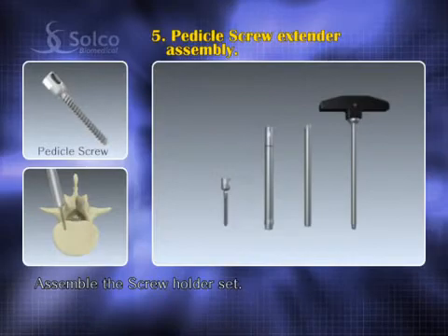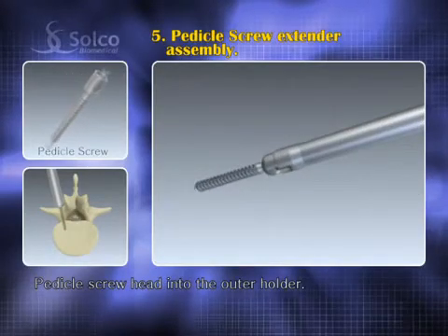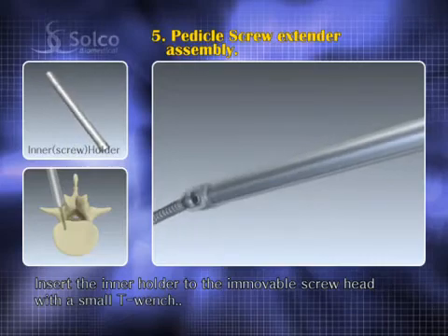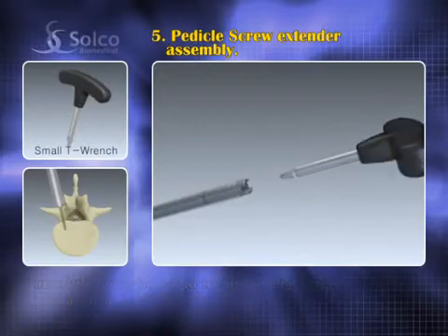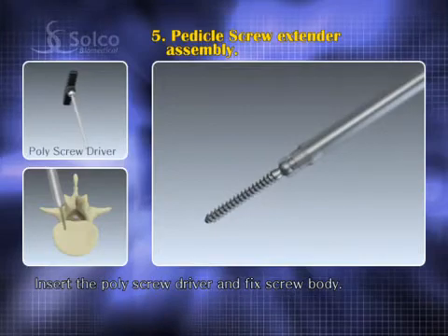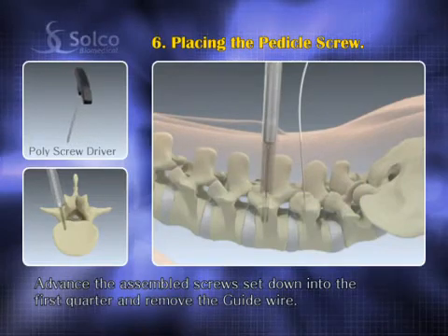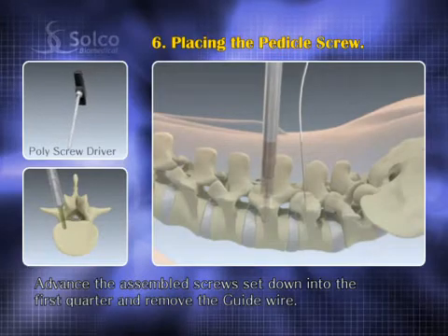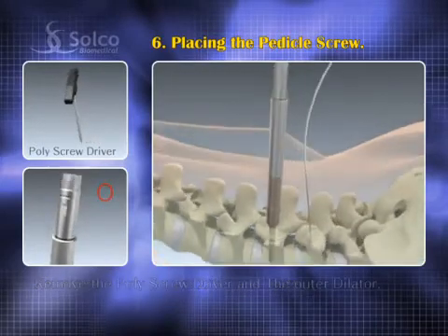Assemble the screw holder set. Put the pedicle screw head into the outer holder to hold it. Insert the inner holder and fasten it to the immovable screw head. Insert the poly screwdriver to fix the screw body. Advance the assembled screw set down to the first quarter, remove the guide wire, then screw down to the three-quarter point. After that, remove the poly screwdriver and the outer dilator.